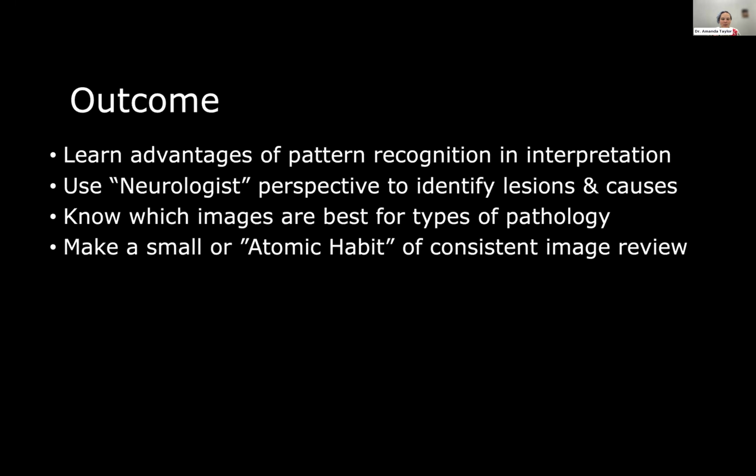So, outcomes or goals of today: to learn advantages of pattern recognition and interpretation, to use a neurologist perspective to identify lesions and causes, because I do think it's a bit different than a radiologist, to know which images are best for which types of pathology, and ultimately to try to start a small or atomic habit of consistent image review.